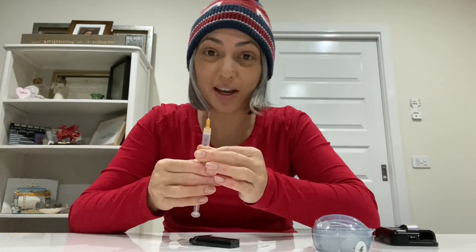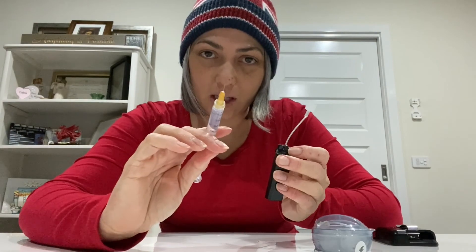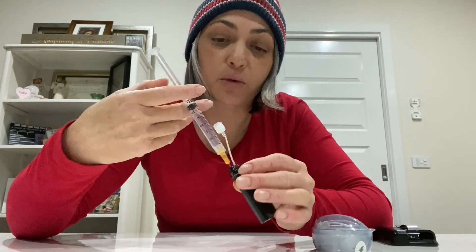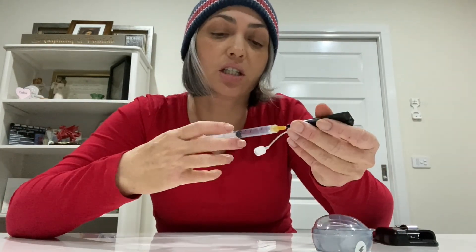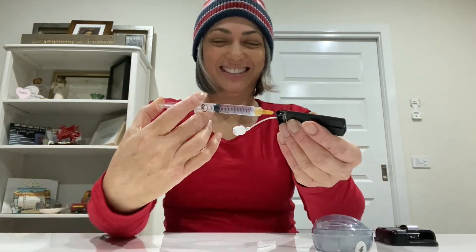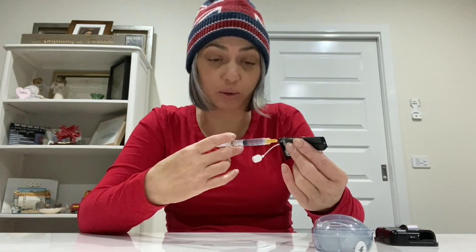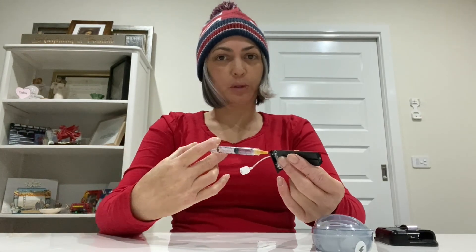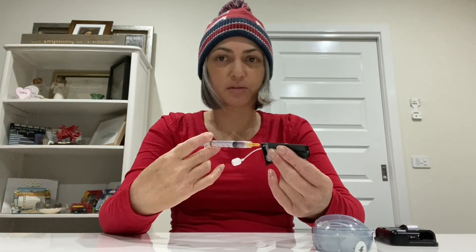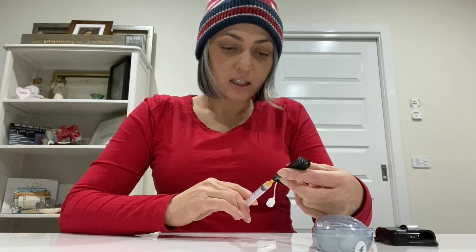All the bubbles are out — awesome. Now I'm going to put the syringe inside the cartridge and squirt the insulin into the cartridge. The maximum fill is three mils. I like to put the maximum so I don't have to change it as often, since the insulin and cartridge last longer that way. Slowly squeezing that in.